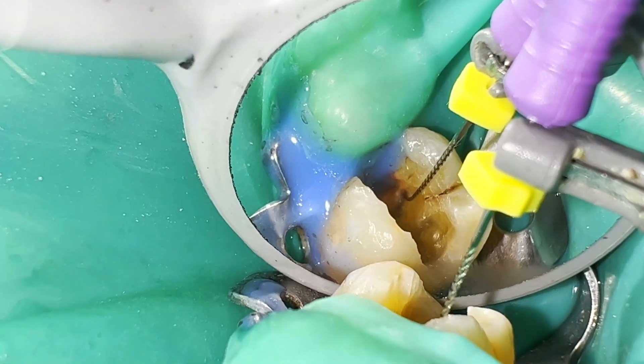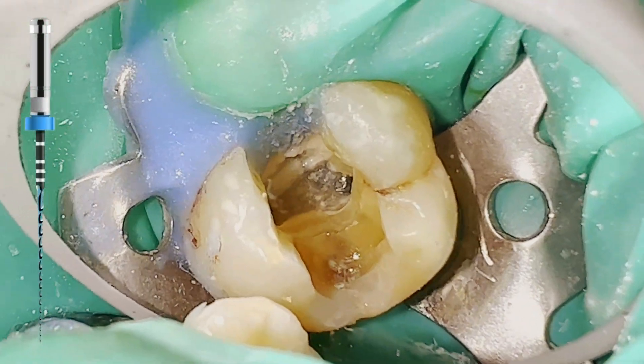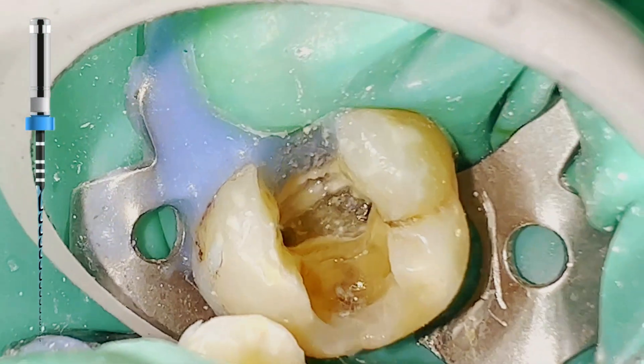Once we have confirmed measurements and a glide path, we begin with the rotary instrumentation. A 15/.04 percent file is then separated in the distal canal due to excessive torque.